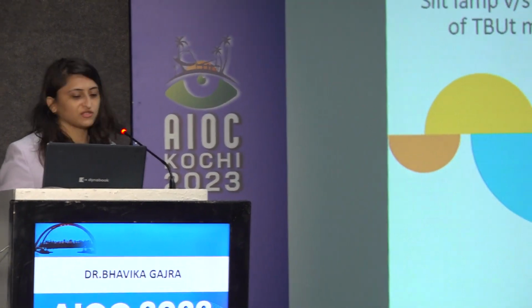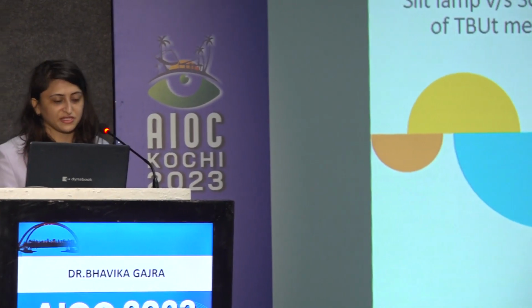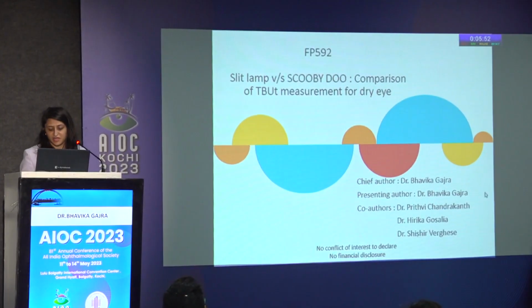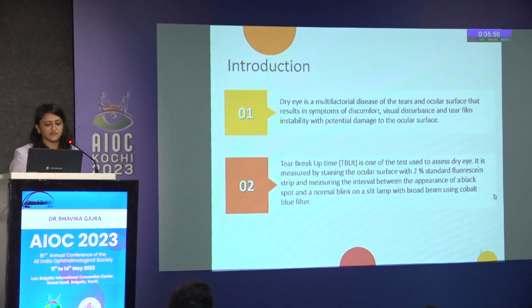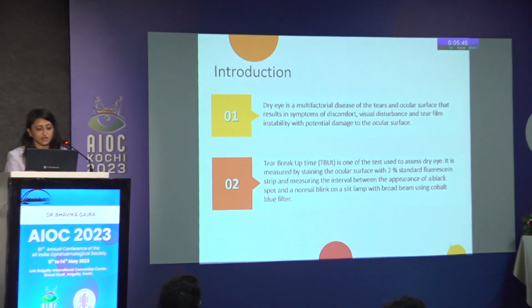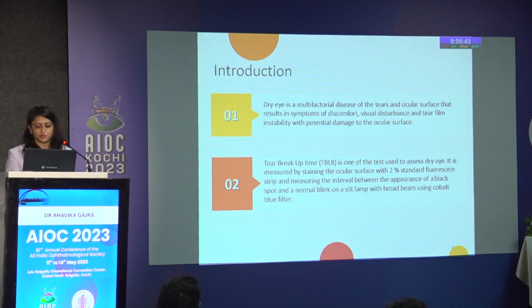I'm Dr. Bhavika Gajra from Arvind Eye Hospital, Coimbatore, resident. I'll be talking about slit lamp versus SCOOBY comparison of TBUt measurement for dry eye disease. Dry eye is a multifactorial disease of the tears and ocular surface that results in symptoms of ocular discomfort. Tear breakup time is one of the tests used to assess dry eye.